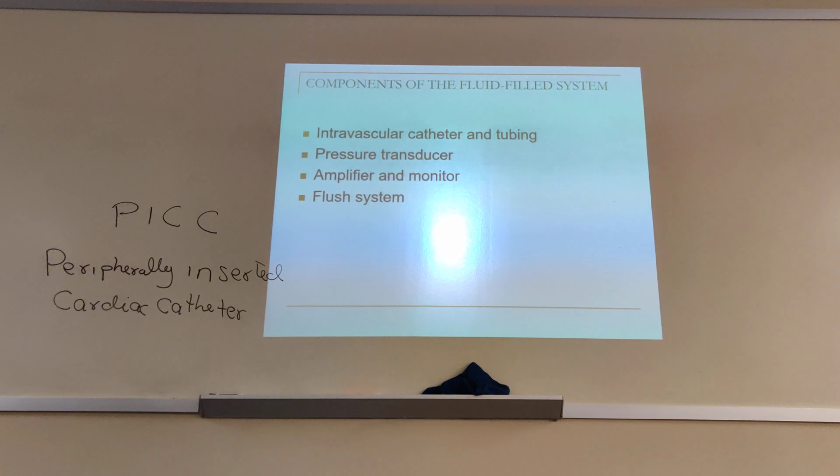So we put enough pressure. There is something here that you use to squeeze. It puts pressure in the bag, and you're going to see a reading here. You want to put enough pressure to make it up to, or a little more than 300, because that's the arterial pressure, or at least greater than the patient's systolic pressure. If you don't do that, blood will be flowing out from the body.